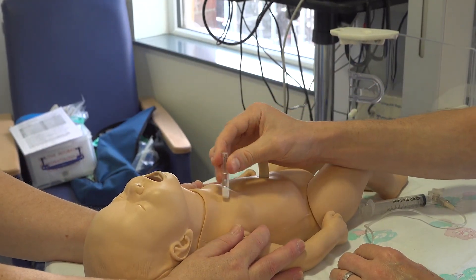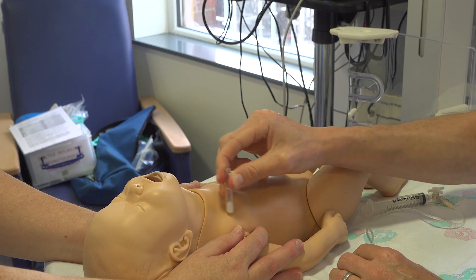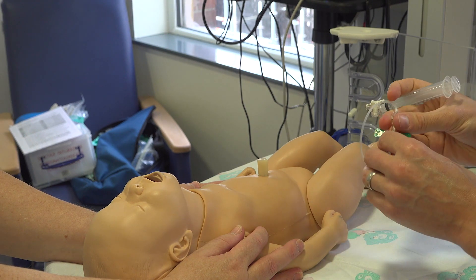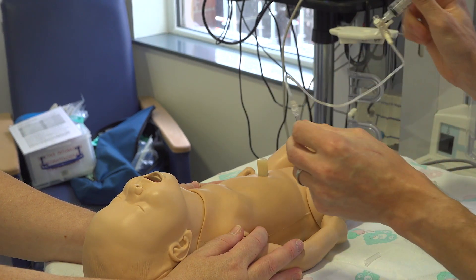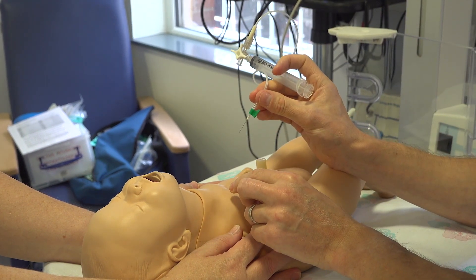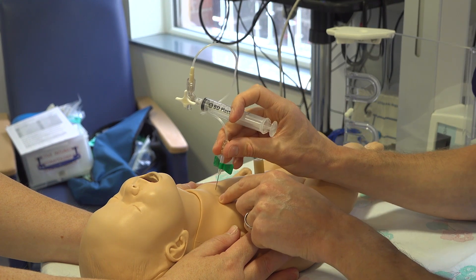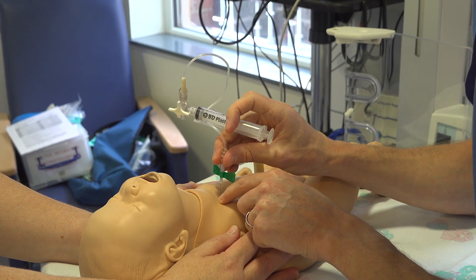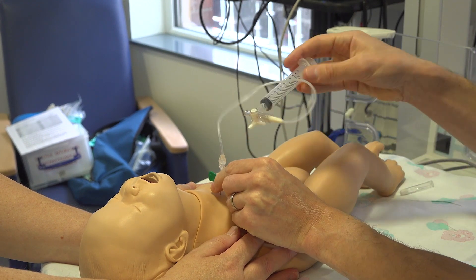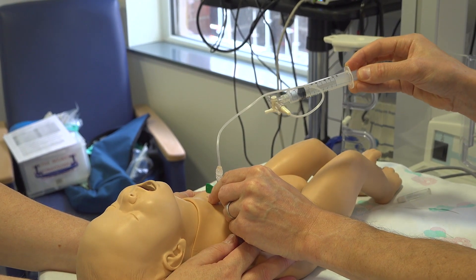Clean the area with your appropriate cleaning fluid and wait 30 seconds. Your assistant is holding the arms. Identify your landmarks — mid-clavicular line, second intercostal space — and insert straight down, aspirating as you go until you hit the air pocket.